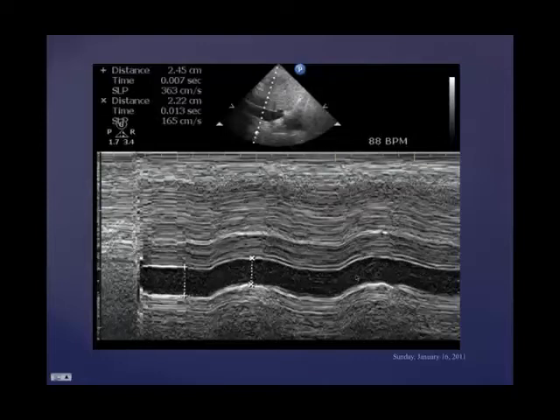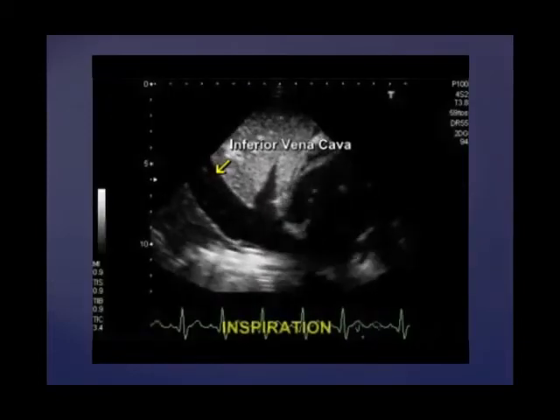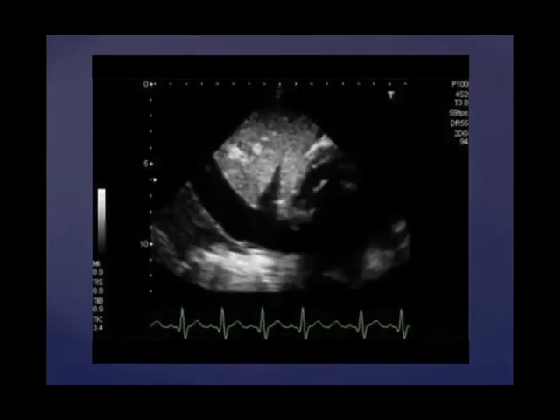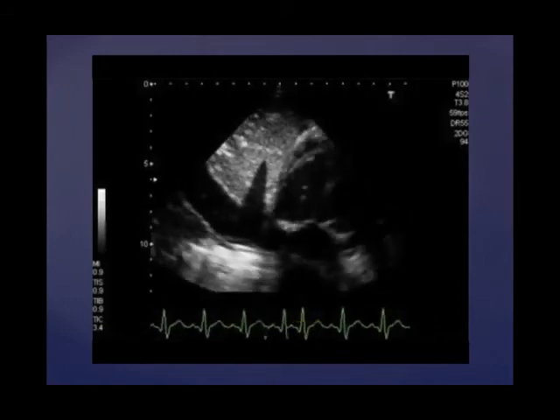So just to go through it again, you're looking for DVT distally, a non-compressible, non-collapsing big IVC, a dilated, non-contracting right ventricle which may have McConnell's sign with the apex working well, a D-shaped interventricular septum with paradoxical septal motion, and an empty or hyperdynamic left ventricle, and you may see clot in the pulmonary artery. There is a big dilated IVC, not collapsing with each inspiration.